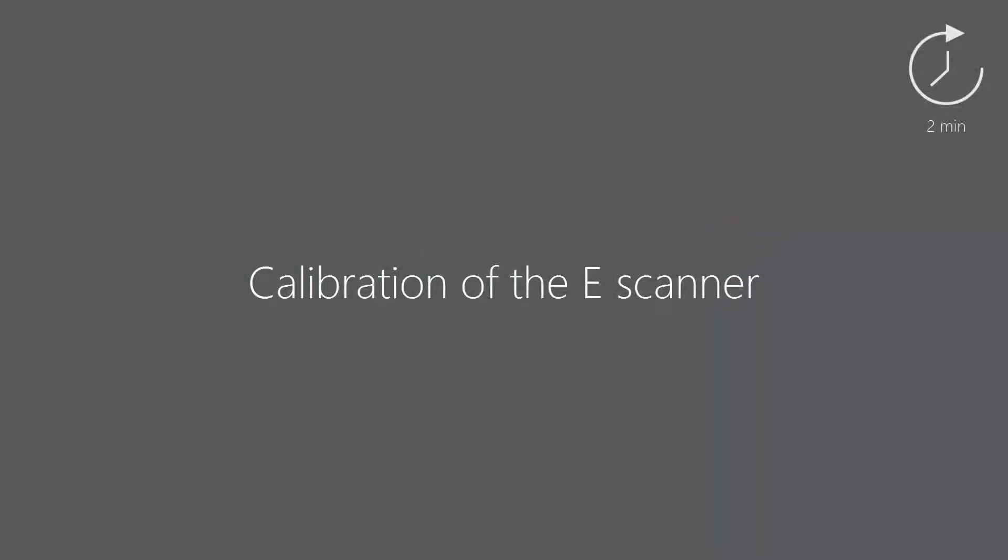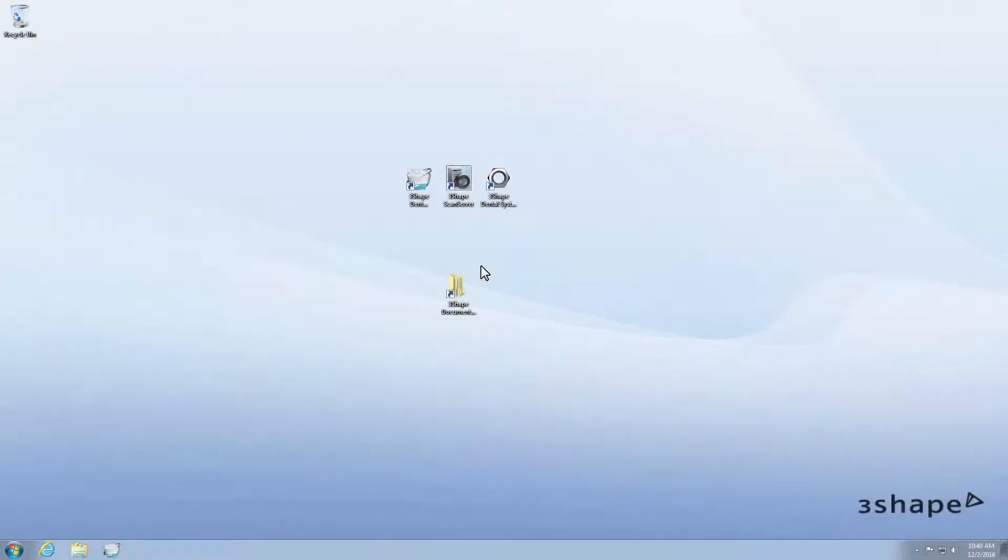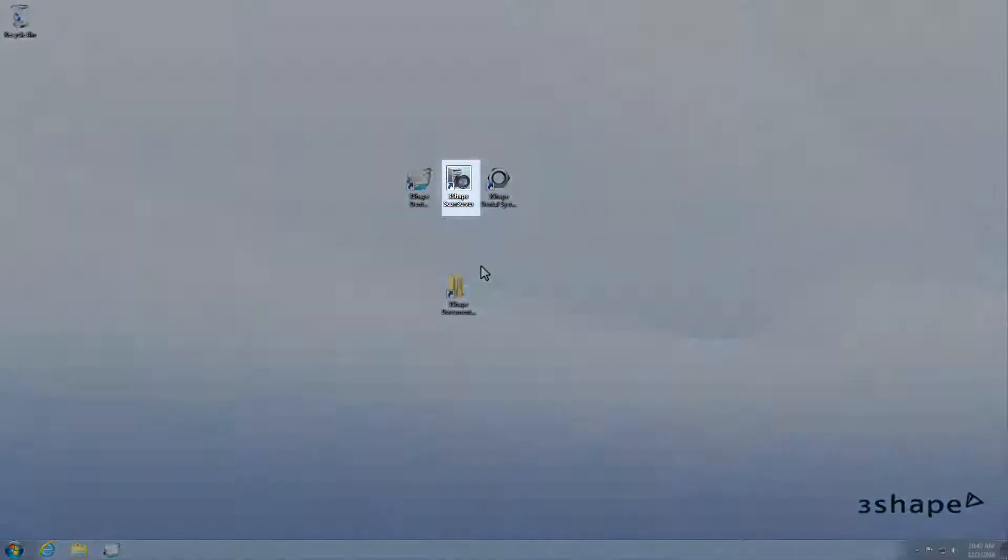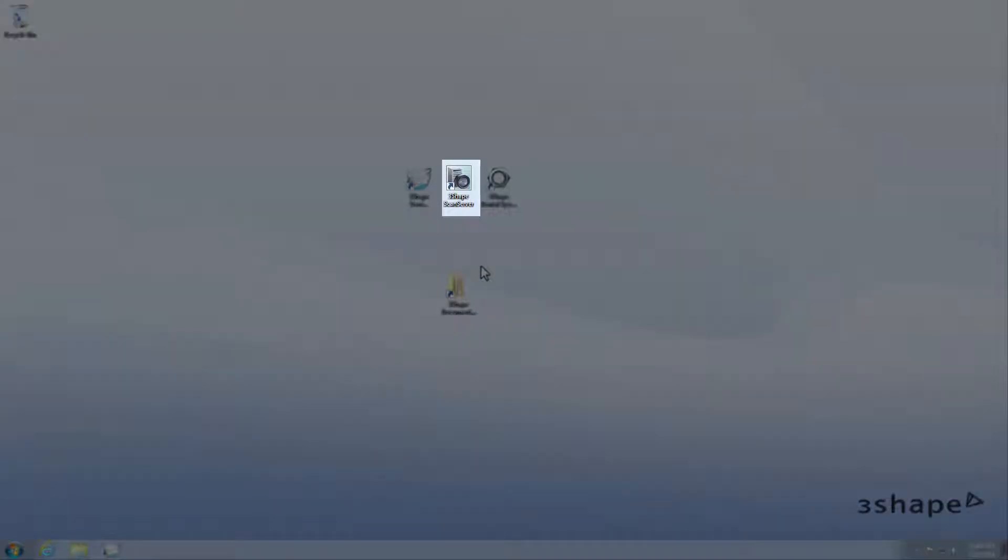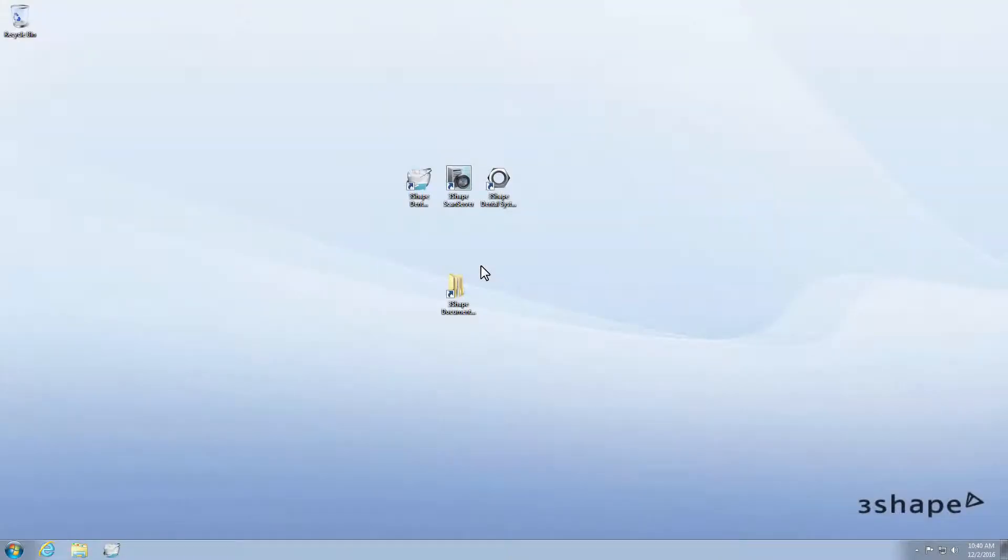Welcome to our eScanner calibration video. Before you start the calibration, make sure that the ScanServer application has been installed on your PC and check for its icon on the desktop, and have the calibration object ready.